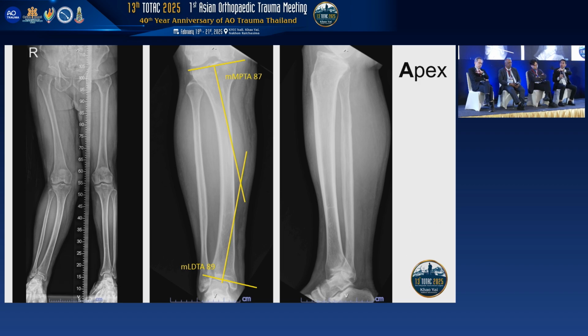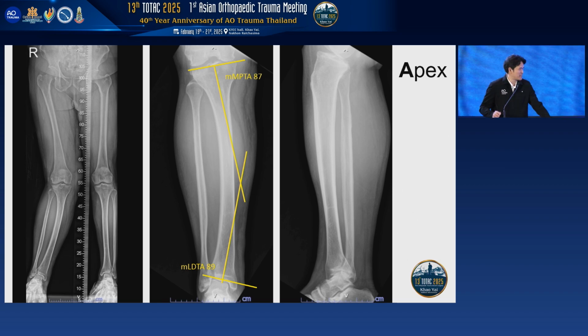We have to draw, I agree with Dr. Su, how much we can reduce the length. Don't forget to cut the fibula as well. Yeah. This is a shortening deformity correction. So you have the opportunity, but you have to draw it anyway. Do we need to do the fibular osteotomy? I think so. Otherwise, you cannot shorten it. Yeah, I should come here before I do the operation.